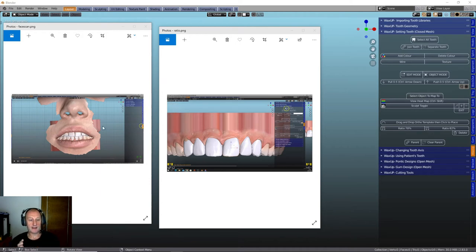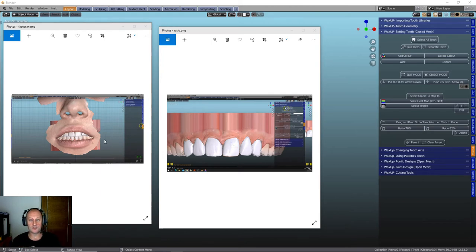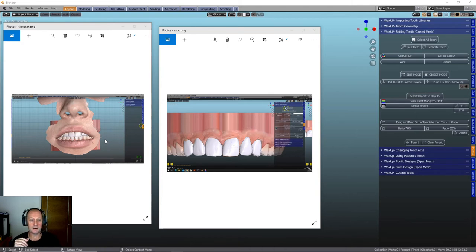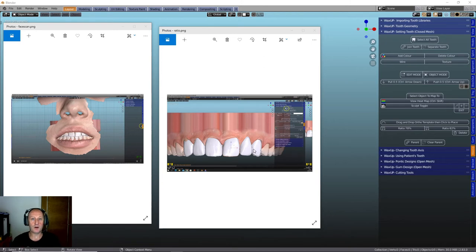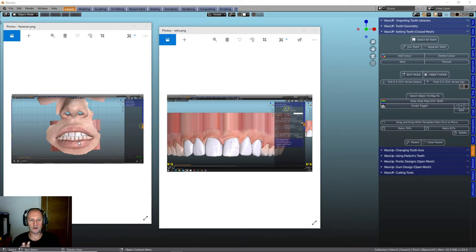The other thing is also face scans. It's very big on getting a face scan in. There's a lot of intraoral scanners that are doing this face scan now, the Medit being one of them. You can bring that in. We can then take that golden proportion template, put it on there, and then we can actually see what those teeth are going to look like and we can move the teeth around.